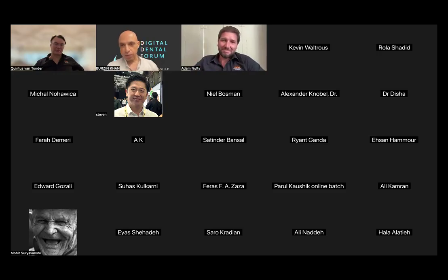Yeah, I think there's a second part to Rola's question where he's mentioned a two segment prosthesis. So I think that also gives us a clue that it depends on the implant positions. If you have a lot of inter-implant distance, and you're going to hamper the zirconia over there, which has got a lot of pontic space, I think it would be better to reinforce as compared to just zirconia. And like you said, Adam, occlusion plays an important role. Plus, what is there in the opposing arch, whether you have zirconia restorations, PFMs, natural teeth or denture teeth, it'll all make a difference.